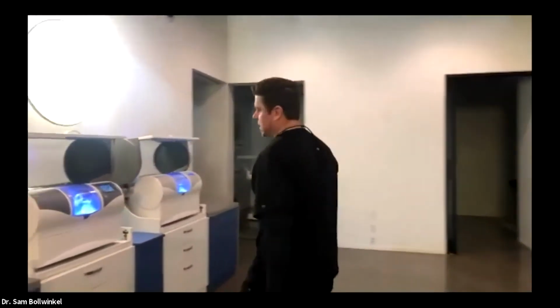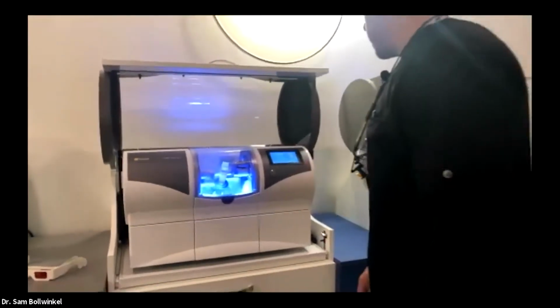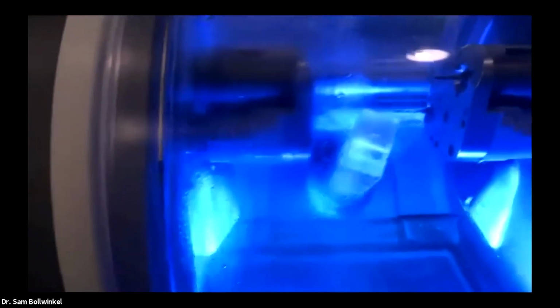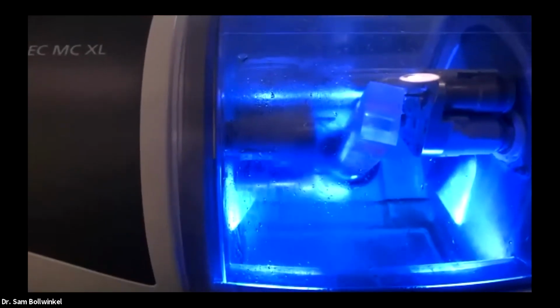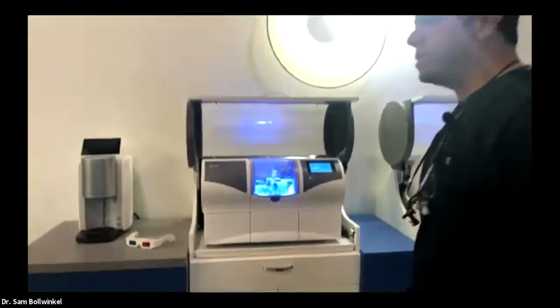So check this out. This is a mill unit. If you haven't seen a mill unit before, this is amazing. Literally, we're going to have you zoom in on this. So this is going to be our guide, and it's going to get ready to mill. I'm going to cue over to a video really quick, and we're going to show you this milling as we get our patient ready. So the patient's getting ready in operatory 1 to go live to provide you that implant experience. While we're getting that patient ready, check out the video of this guide getting made.